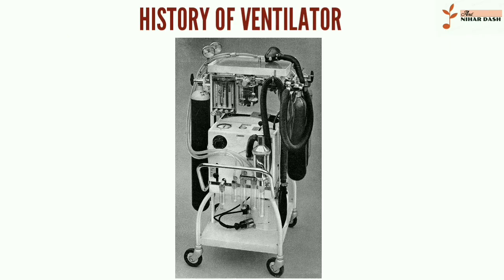History. The history of mechanical ventilation begins with various versions of what was eventually called the iron lung, a form of non-invasive negative pressure ventilator widely used during the polio epidemics of the 20th century. After the introduction of the Drinker respirator in 1928, improvements introduced by John Haven Emerson in 1931-5, and the Both respirator in 1937.